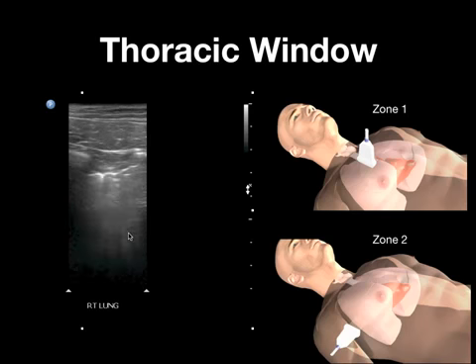And sonographically, what you're going to see, this is a sagittal exam with the indicator directed towards the patient's head. You've got the subcutaneous tissue here, pectoralis muscle. You always want to identify the ribs. That way you don't confuse a fascial line for the pleural line. And here you can see the pleural line, and you can see the lung sliding back and forth, and you can see intermittent comet tails or ring downs emanating from the pleural line.